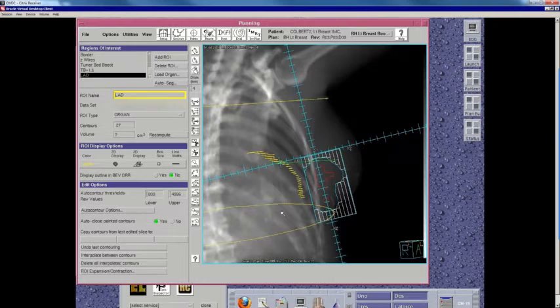So we all make mistakes, but I've tried not to make that mistake again. One way to get around that is if you put the CT image on bone windows, oftentimes it's really easy to tell what's a calc and what's a clip, because the calcs won't be as bright. But yes, so you first of all have to decide in your heart, are you confident you have any clue where the tumor bed is?